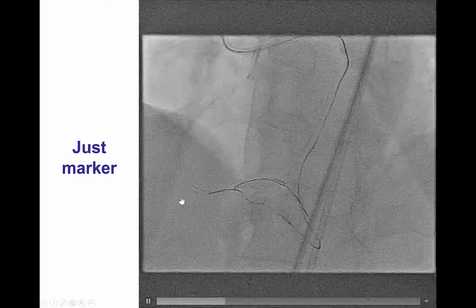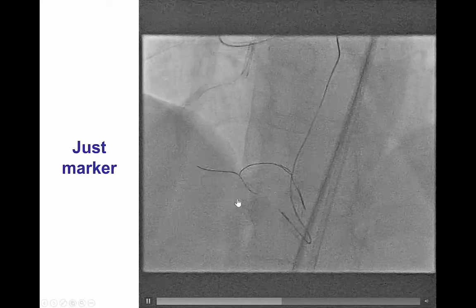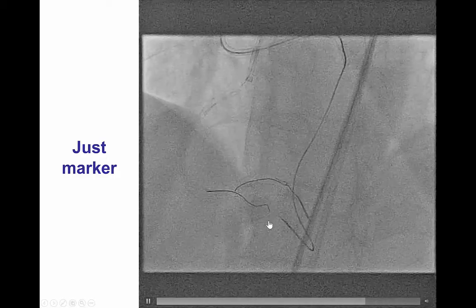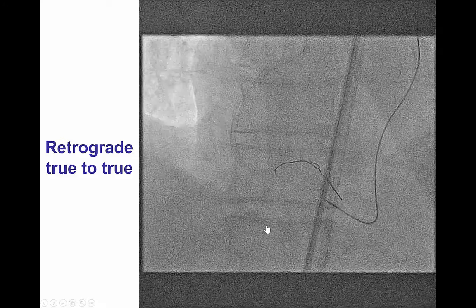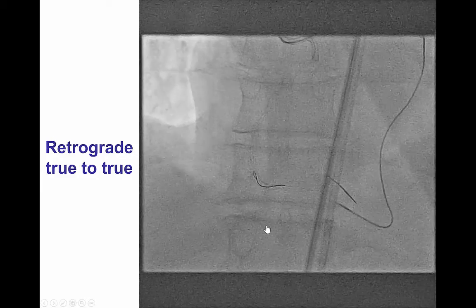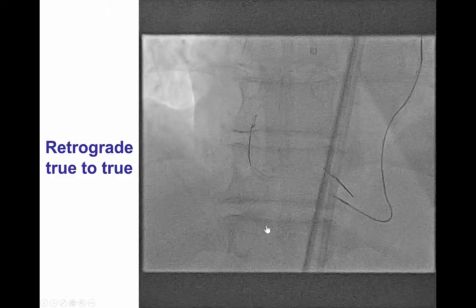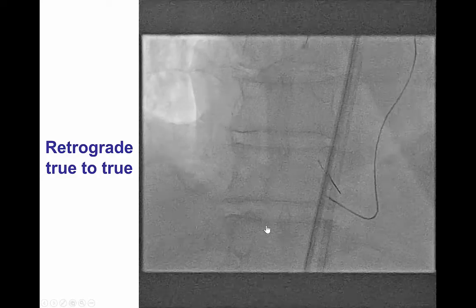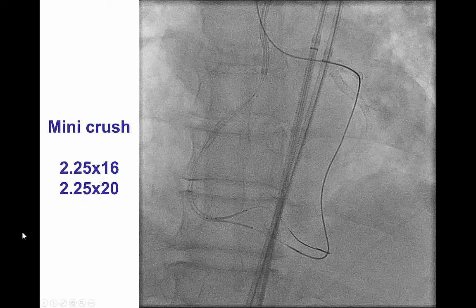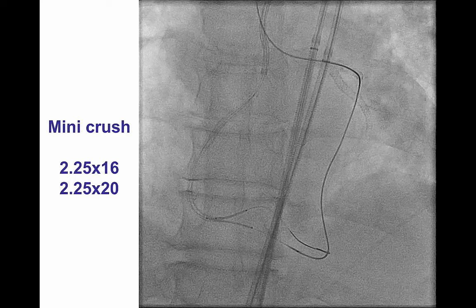We then used the retrograde wire as a marker, trying to advance an antegrade wire into the PDA, which was unfortunately unsuccessful. As a result, we finally performed retrograde true-to-true lumen puncture.